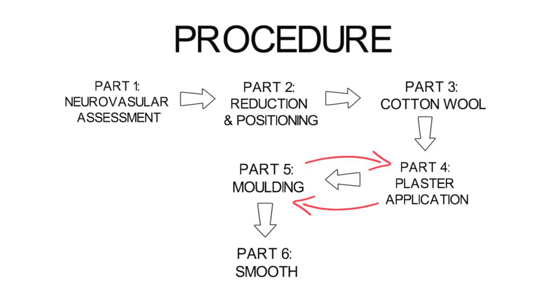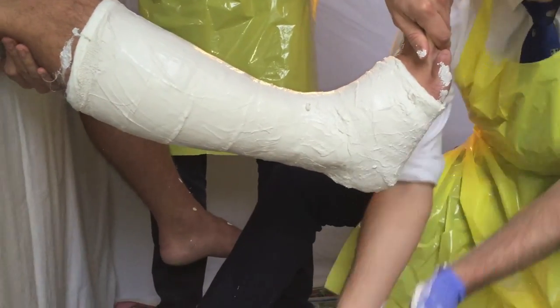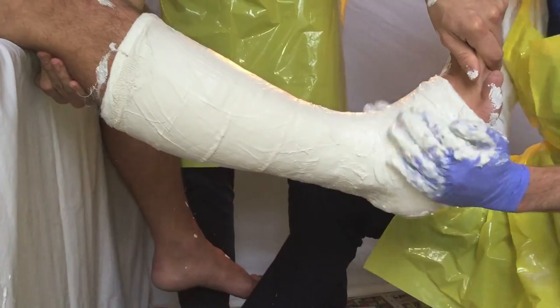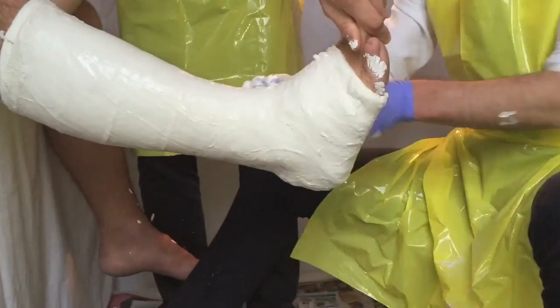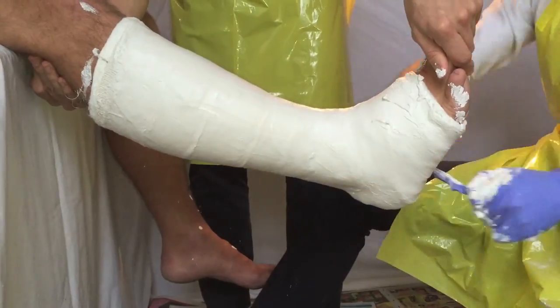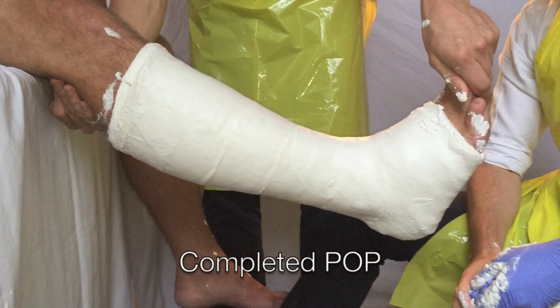The final phase of the procedure includes smoothing down the cast surface. One needs to constantly mould the cast using the palmar surfaces of your hands, repeatedly, to form a union between the various layers and increase the strength of the cast. A handy tip in the final stages is taking off one of your gloves and using the smooth inner surface of the glove to rub it continuously against the cast. This creates a smooth surface and a pleasant aesthetic result.